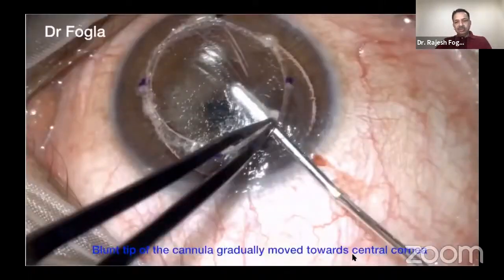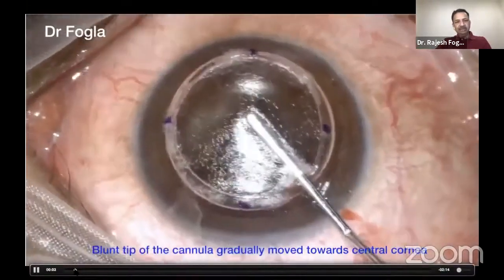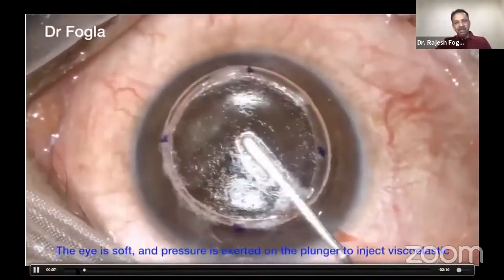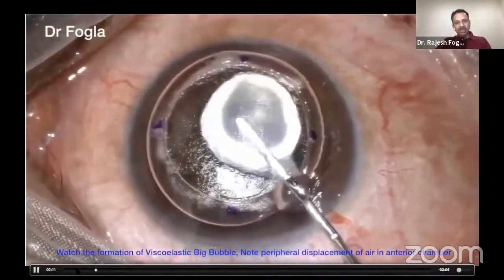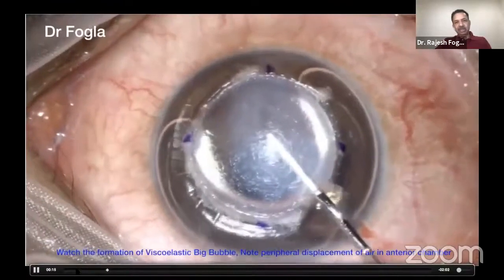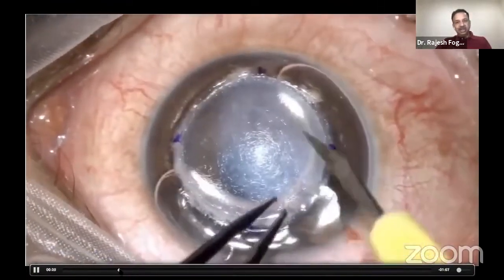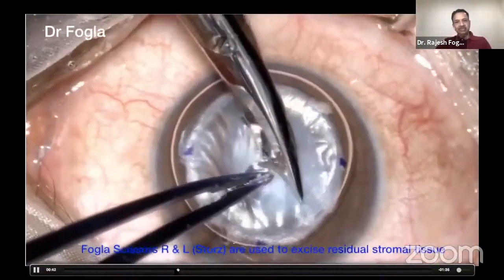At times, you can even use the viscoelastic technique where you put in your cannula at about 85 to 90% depth. You have to make the eye soft, put an air bubble in the anterior chamber. The counter pressure has to be minimal as compared to air because the viscoelastic is more dense. And then when you inject viscoelastic, get the visco bubble, you can see the air bubble getting displaced to the periphery. And then you can open up the visco bubble, and the rest of the steps are pretty much similar.